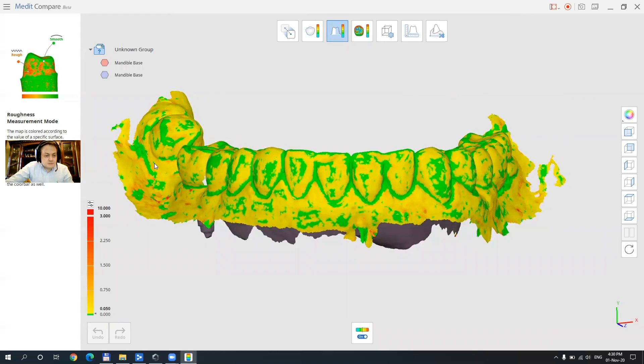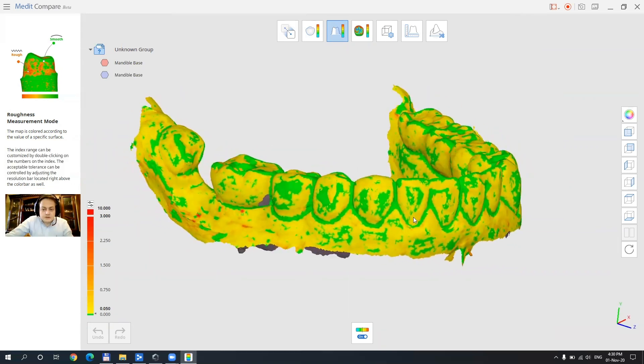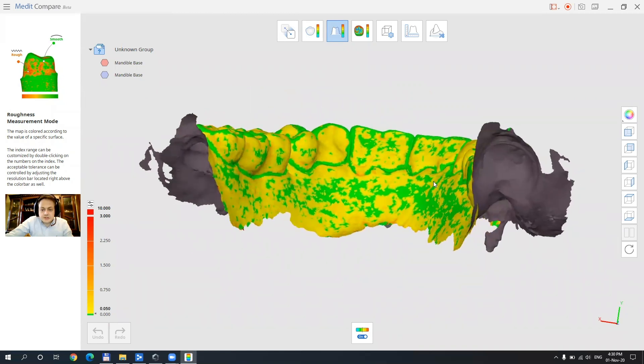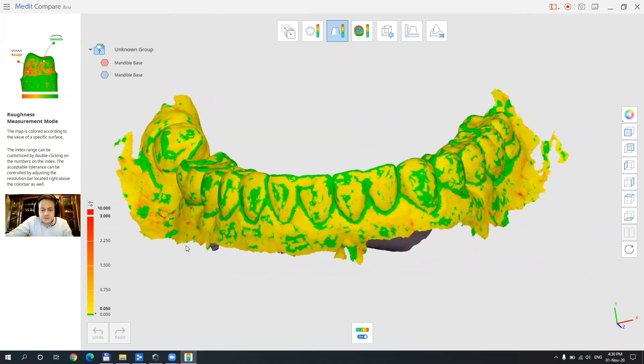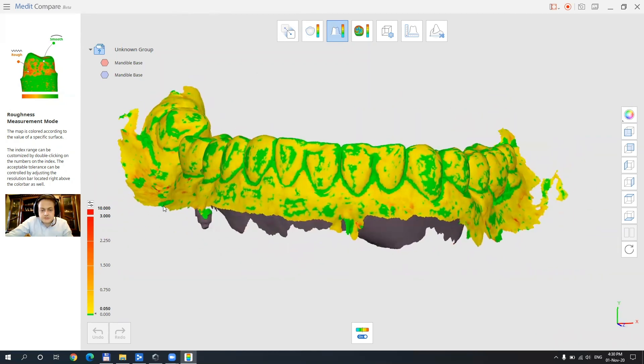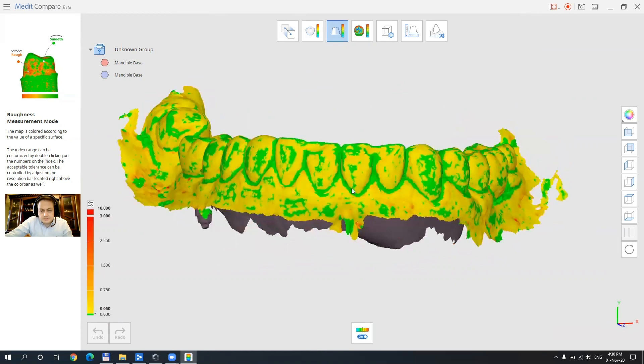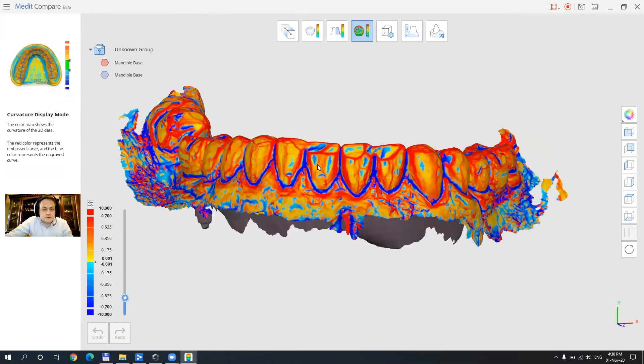And of course there is a very beautiful rendered color scale that is very helpful to us. We can disable the color scale if you want and let's just go to the third function. Third function is a curvature display mode.